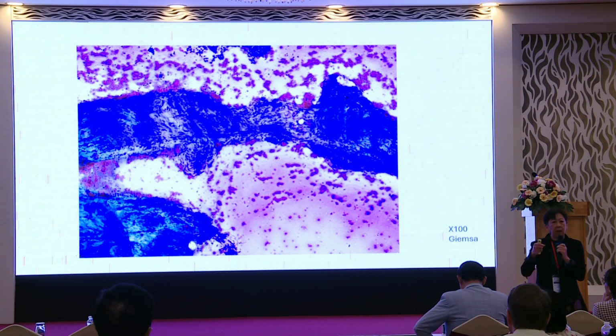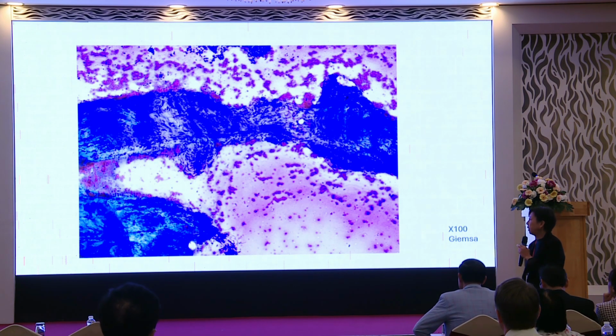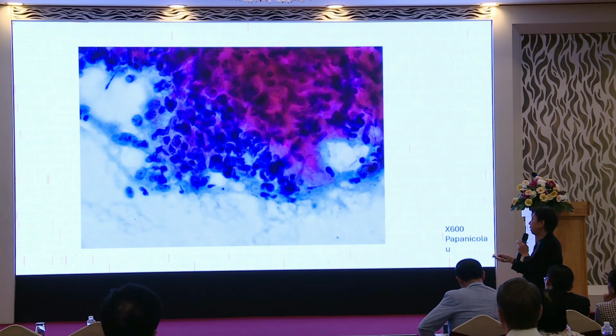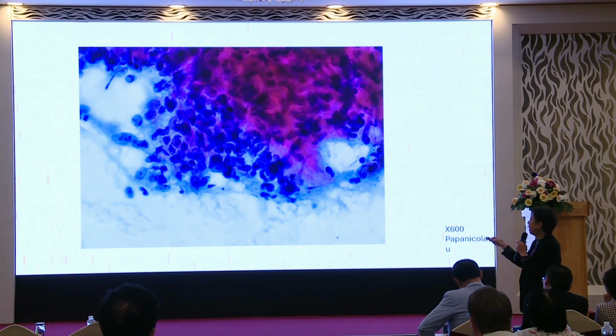So a lot of cytology depends on the person who is doing the smearing. And my old mentor in cytology said, sometimes you feel like telling the surgeon that the slide was spread by her thumb, and it's not useful. But she found a few atypical cells at the edge. So when you look at these fragments, look at the edge, because sometimes the edge of the fragments will be nice looking cells, pretty cells that help you. So again, you see these rather nasty looking cells.